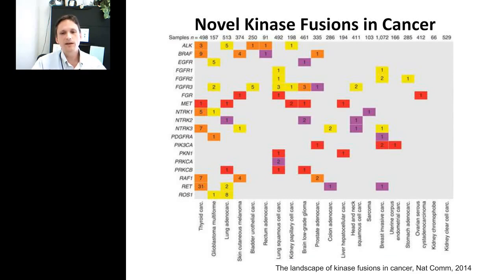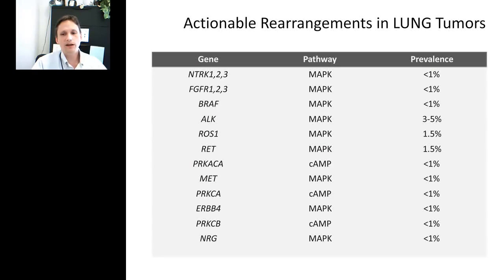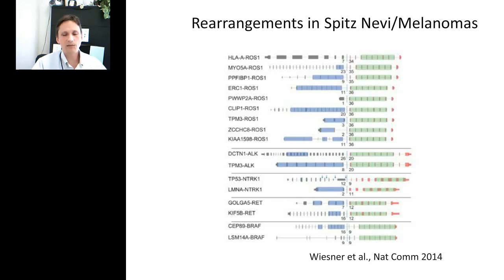was confirmed positive by AMP. Even in the past year or so, there's been a number of papers, including this paper from the Blueprint Medicines group, that has described even more novel fusions of kinases in cancer. So we've worked hard to continue to keep up with the literature, which is not always easy. Within lung, for instance, the number of fusions has gone from ALK, RET, and ROS to probably about 20 genes now that we're actively looking at and need to keep track of.